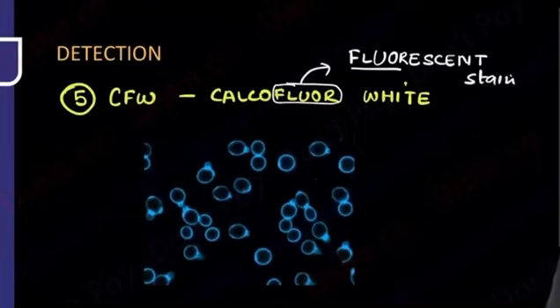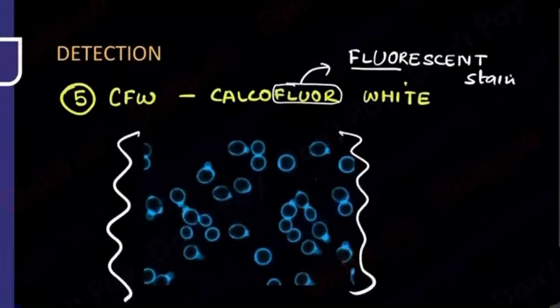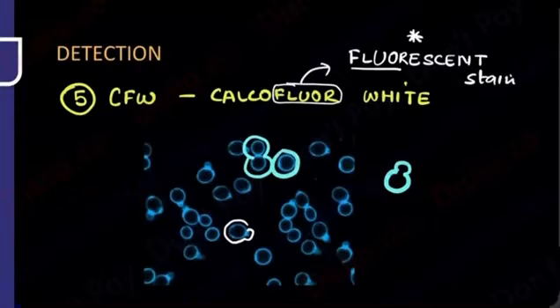So, can you now see the background is all black? I've got you a black background because it's all dark, and what is going to come up in front of it is something shining. Why is something shining? Because you've used a fluorescent stain, right? But having said that, did you also notice that the entire fungus has not become shiny? Only the outline over here and the budding is becoming shiny. Why so? Outline means what?